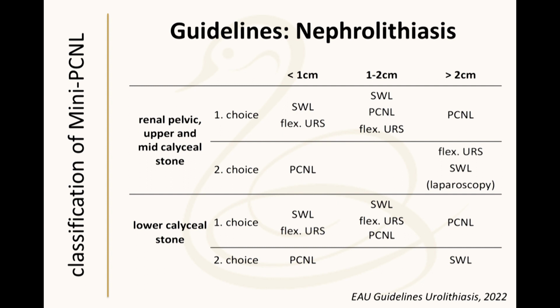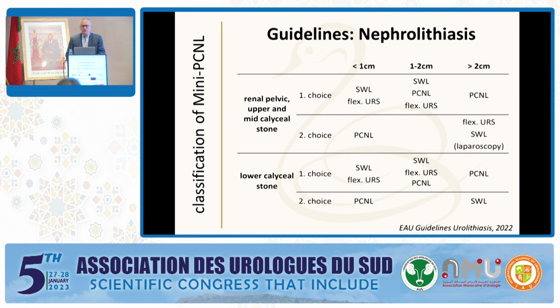If we have a look at the guidelines of the European Association of Urology about urolithiasis treatment, only conventional or standard PCNL is mentioned, and there is a clear indication for stones that have a diameter more than 2 centimeters. But there is absolutely no information about the term mini PCNL.